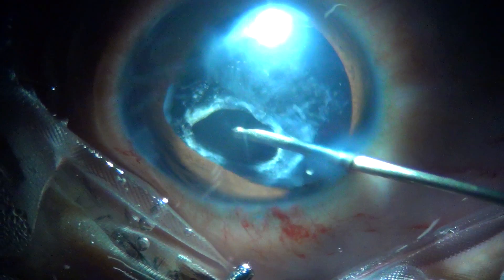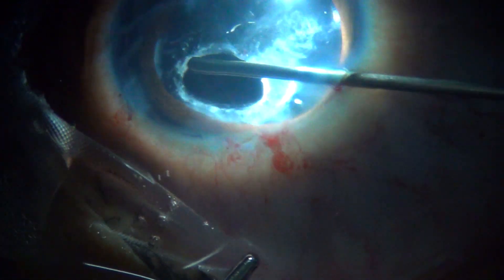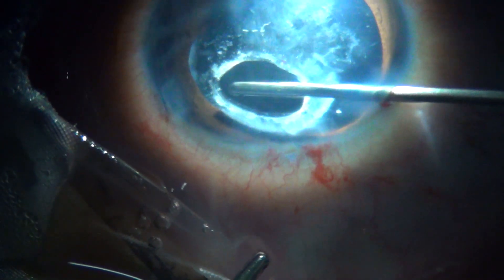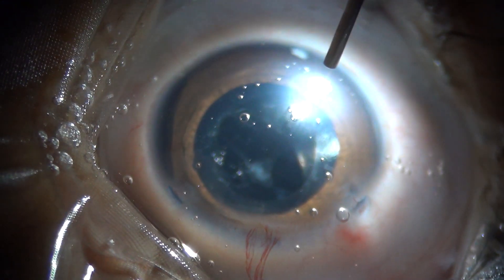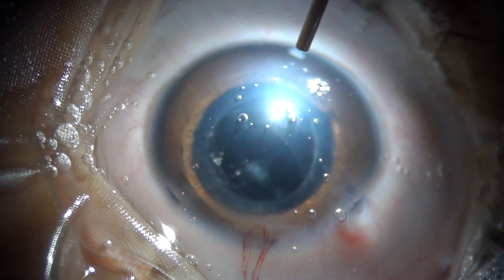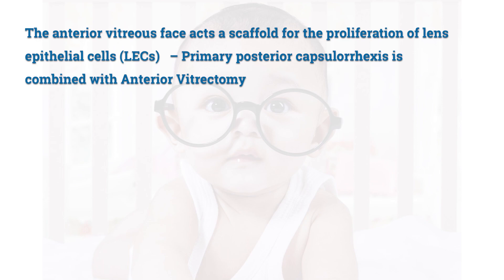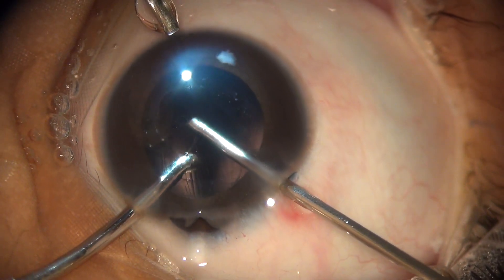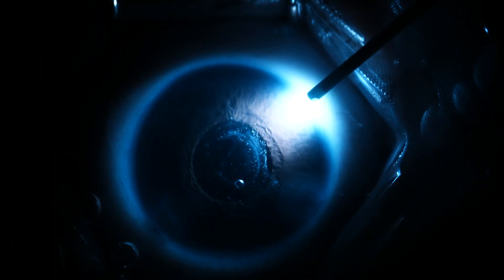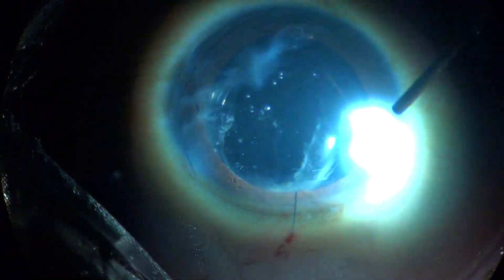If the posterior capsule is left intact, there are more chances of developing significant posterior capsular opacification. The opening of primary posterior capsulorexis should be smaller than the anterior capsulotomy but large enough to leave a clear visual axis. The anterior vitreous face acts as a scaffold for proliferation of lens epithelial cells, and hence primary posterior capsulorexis is combined with anterior vitrectomy. Endolite provides better visualisation during these steps.